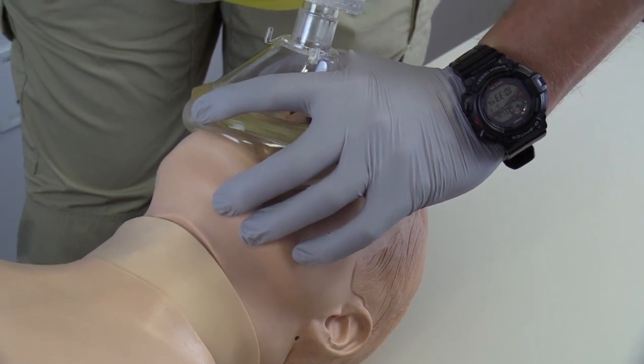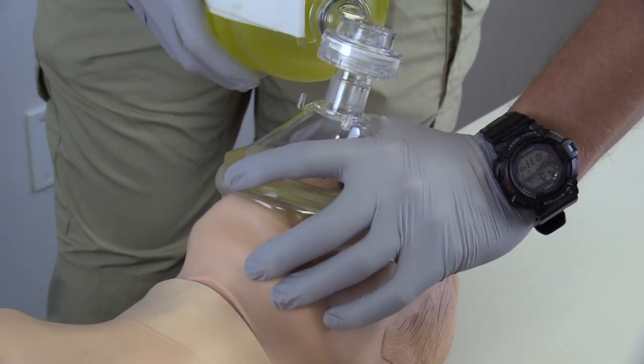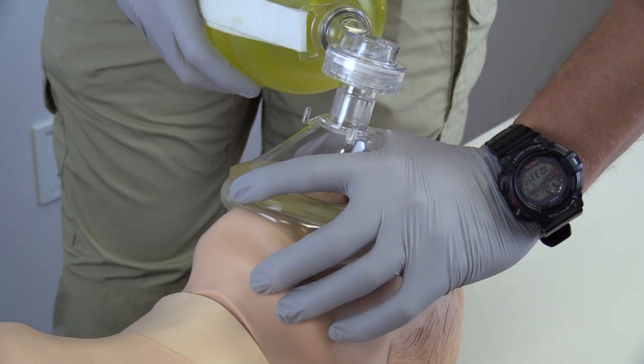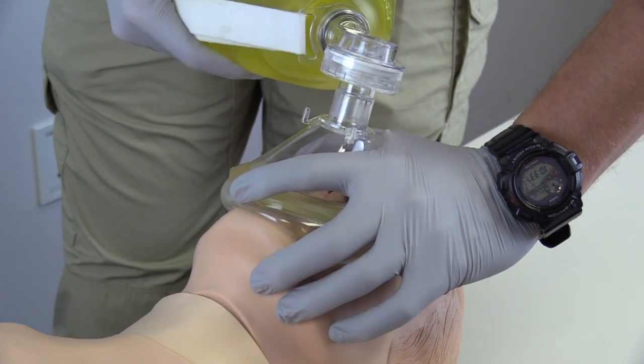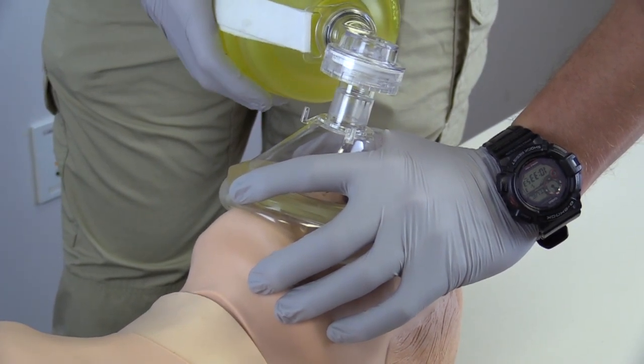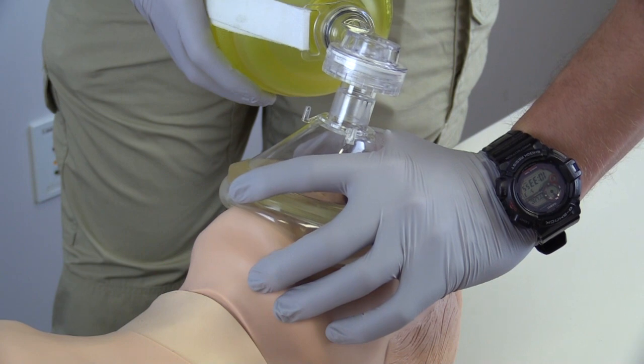I need to ensure I am delivering appropriate volumes without ventilating too quickly or forcefully. If no pulse is present, I will begin CPR.